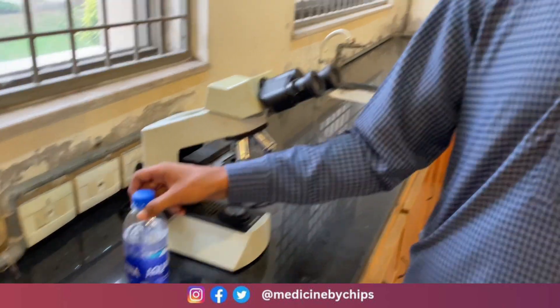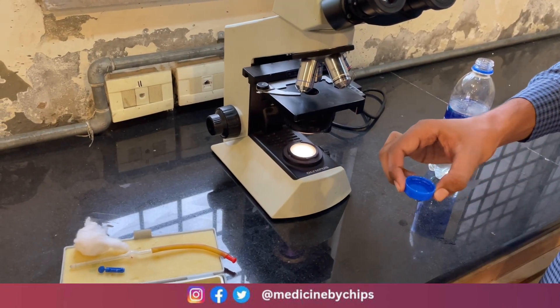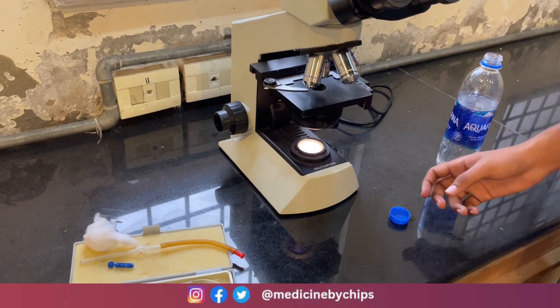There are three solutions which are used in this process: one is called Hayem's fluid, another is Dacie's fluid solution, and the other is normal saline. Today we have normal saline, and we will take 2 ml of the saline solution.